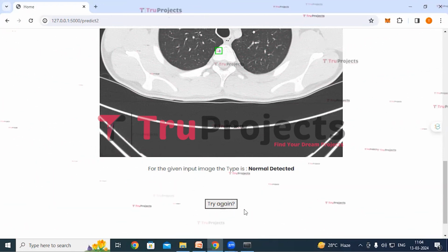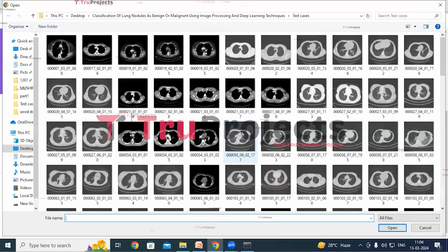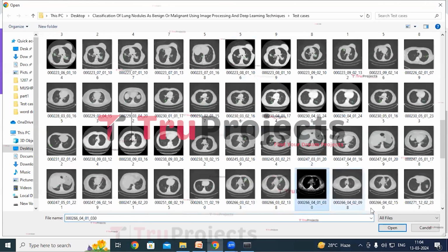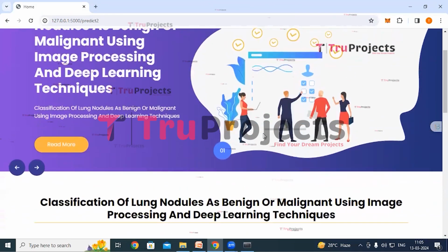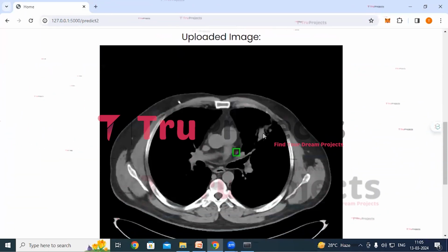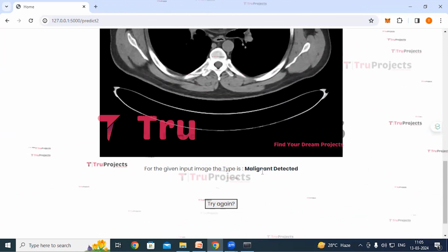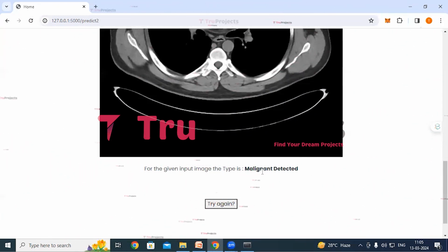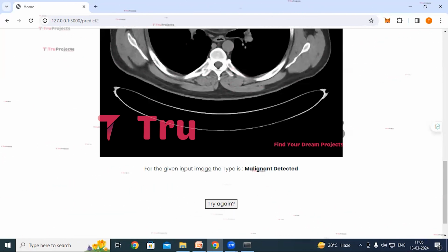We'll try again. Click on try again button. Click on choose file button. So this time I'm selecting this one and click on open. The image is loaded. Now click on upload button. This is the uploaded image and here we can see the classification, that is malignant. So malignant means it is cancerous nodule that can spread and cause lung cancer. So early detection is important for treatment.